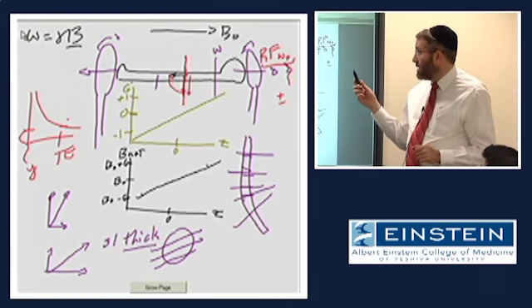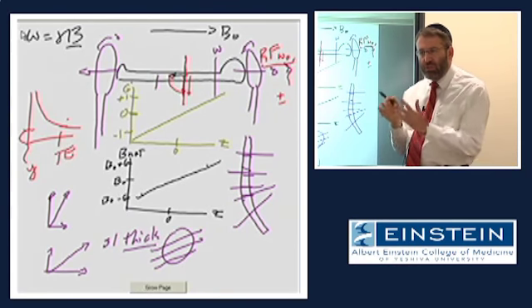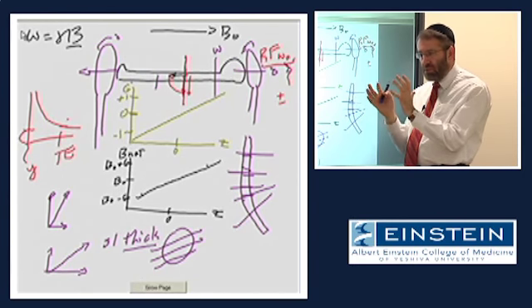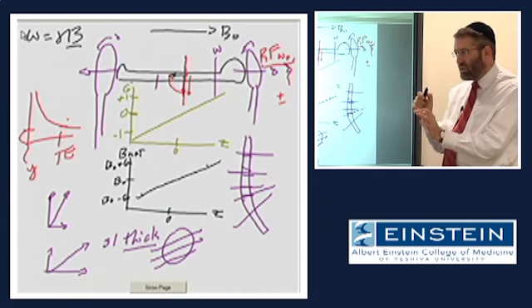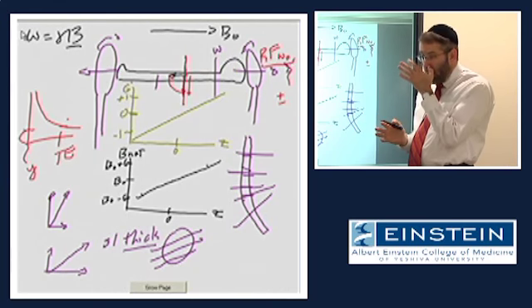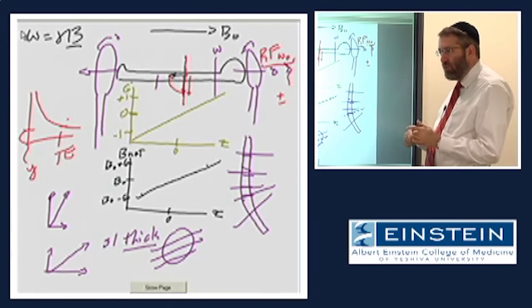It would just be an unattainable engineering feat for us to generate an RF, which is essentially just a loop of wire with an alternating current running through it, as we discussed yesterday, that oscillates at precisely a single frequency. There's no such thing. It is always going to be some tolerance, some range of frequencies.